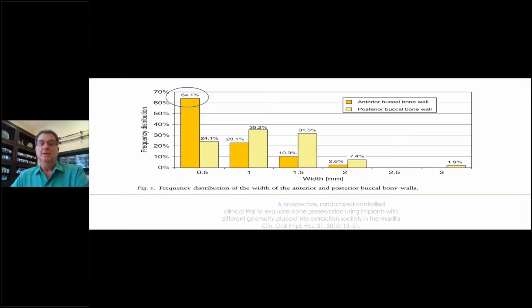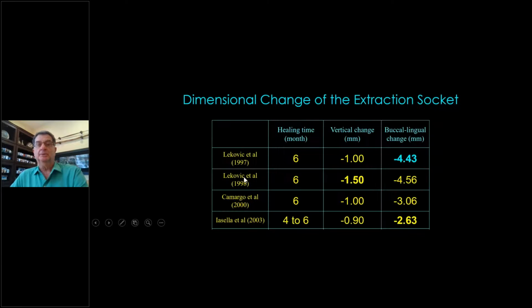So they're all thin. Now, this is what confused me quite a bit when I first looked at the data and why I was worried about immediate sockets. This is partly what Abdul showed also with the original research. Lekovic and Kenny did 6 anterior teeth. They opened the flap. And look at the changes in the ridge. Camargo, Araujo. And you start looking at these results from way back, 1997, 98, 2000.